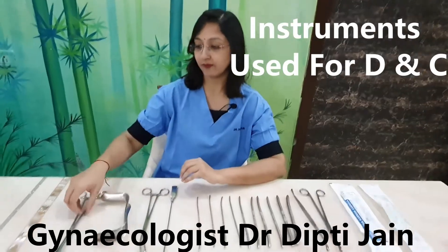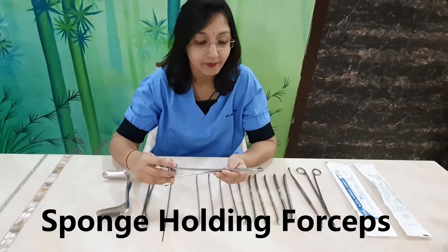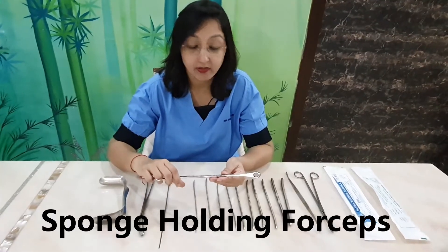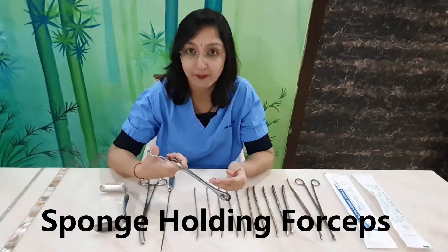Coming first to the sponge holding forceps. This is a sponge holding forceps — it is used for painting. We paint the vaginal and perineal area with betadine with the help of this sponge holding forceps.